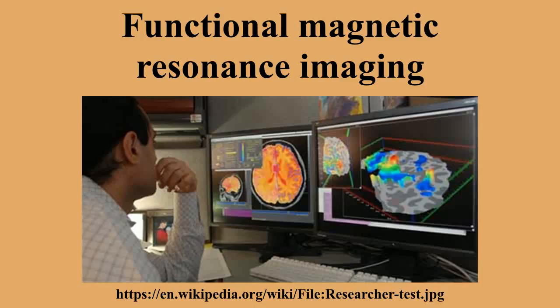Mapping of functional areas and understanding lateralization of language and memory help surgeons avoid removing critical brain regions when they have to operate and remove brain tissue. This is of particular importance in removing tumors and in patients who have intractable temporal lobe epilepsy. Lesioning tumors requires pre-surgical planning to ensure no functionally useful tissue is removed needlessly. Recovered depressed patients have shown altered fMRI activity in the cerebellum, and this may indicate a tendency to relapse.